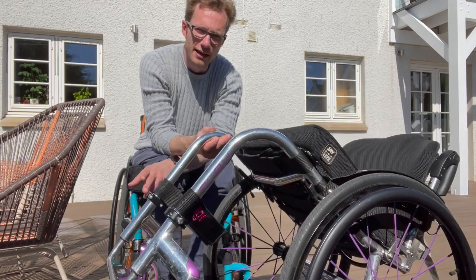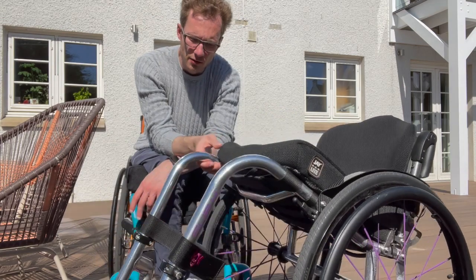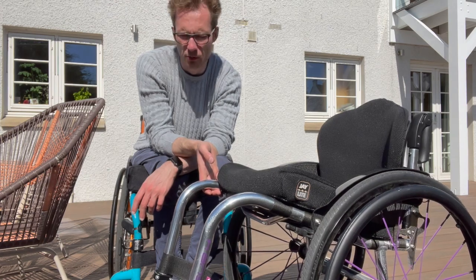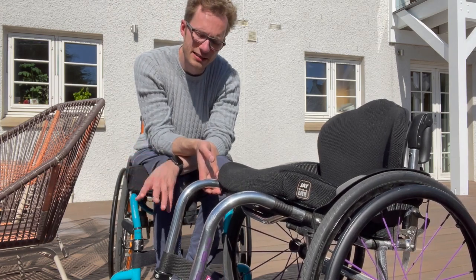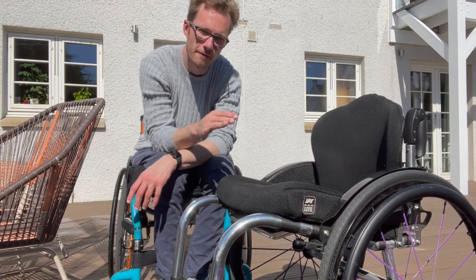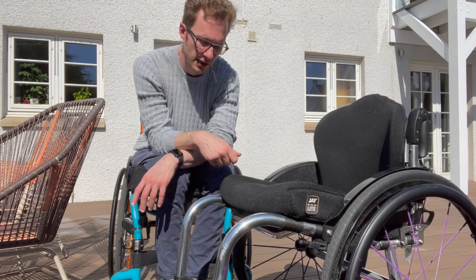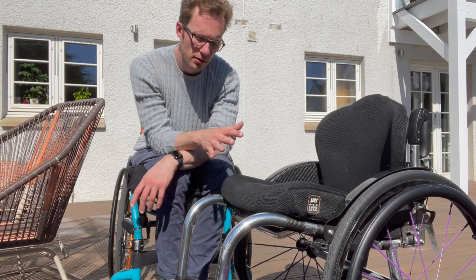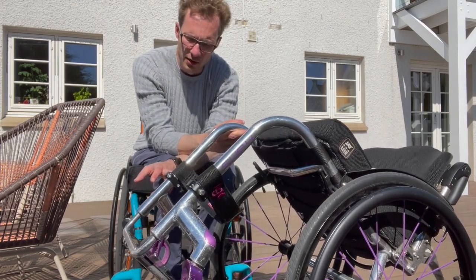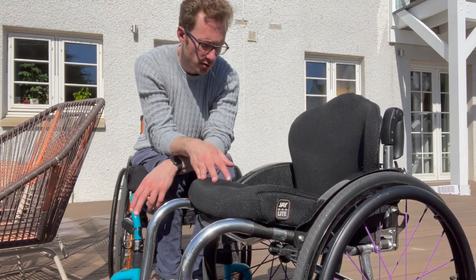One more thing I forgot to mention about the actual frame: there are little attachments here for a front wheel — RGK's version of the freewheel. It's effectively a third or fifth wheel that goes out front, but rather than attaching to the footplate as the standard freewheel does, it attaches to the frame, thereby eliminating any flex or bend I experienced in the footplate when going over rough terrain. I'll do a separate video on the front wheel — it's a great piece of kit — but it did add a little weight to the overall chair.